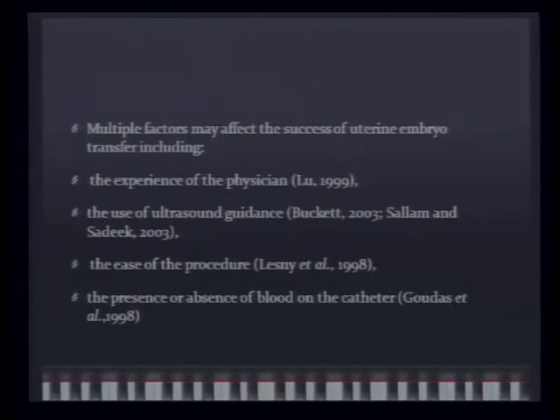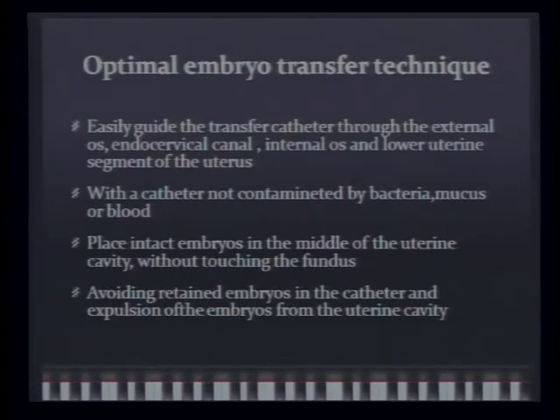Multiple factors may affect the success of the uterine embryo transfer, including the experience of the physician, which is very important, the use of ultrasound guidance, the ease of the procedure, and the presence or absence of blood on the catheters used. What is the optimal embryo transfer technique?